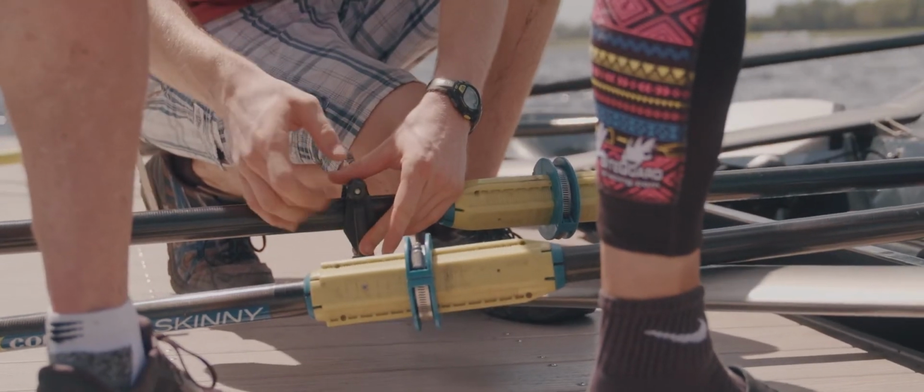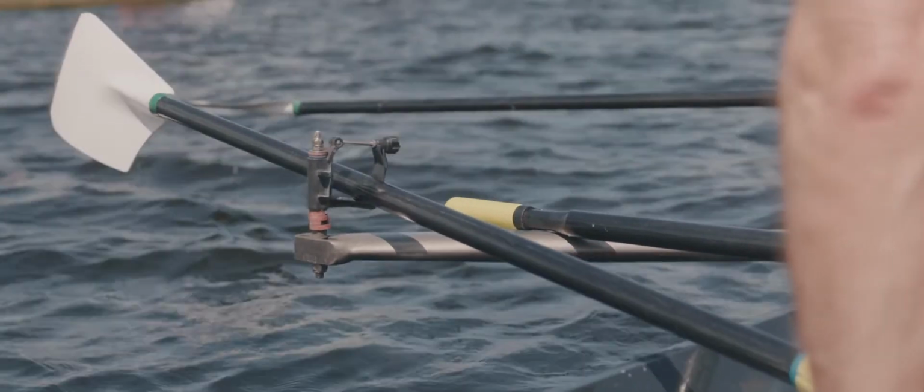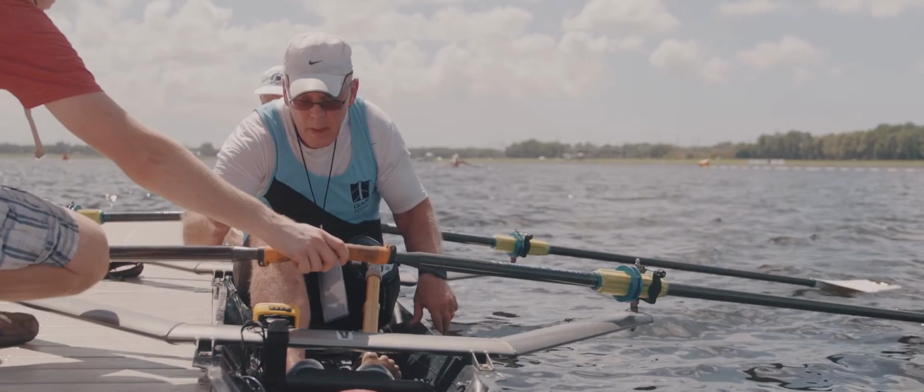This socket doesn't have any restriction. The strap is lower down and you can get a full motion, and now I can row naturally for the first time, and it has made, I would say, about 10 seconds per 500 meters faster as a consequence of this socket.